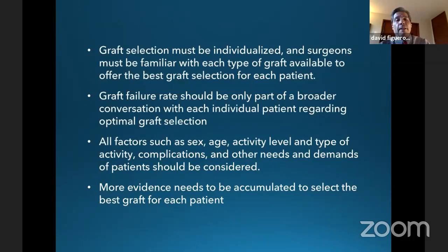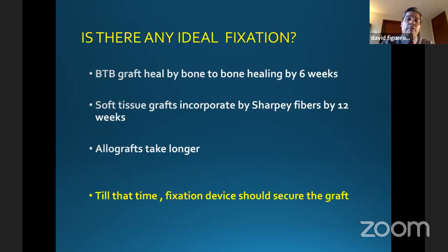And the other question is, is there any ideal fixation? We know that BPTB graft heals by bone-to-bone healing very fast, and soft tissue graft is incorporated by Sharpey fibers at double the time, 12 weeks. We know that allograft takes longer. So until that time, the fixation device should secure the graft.